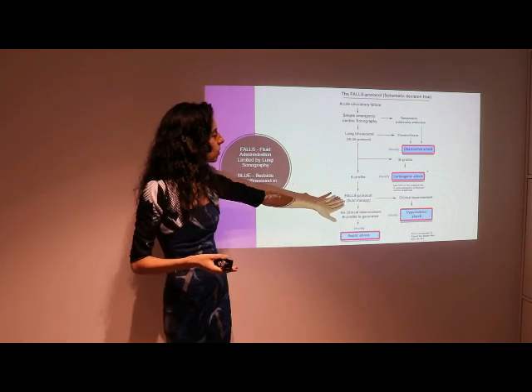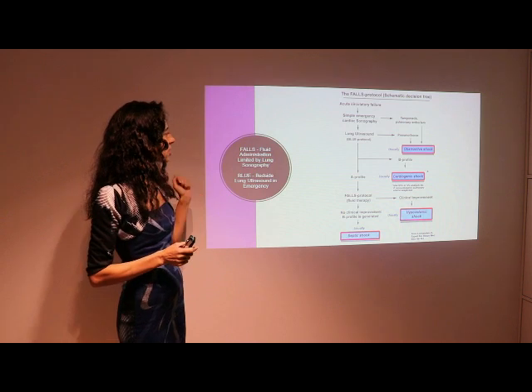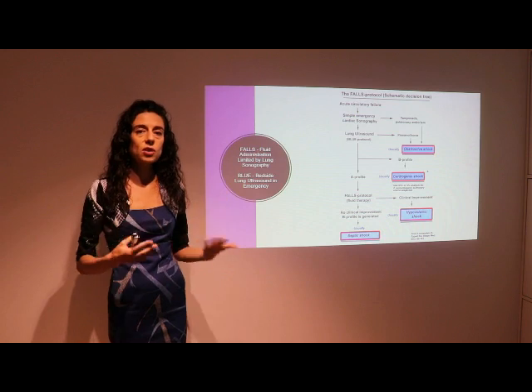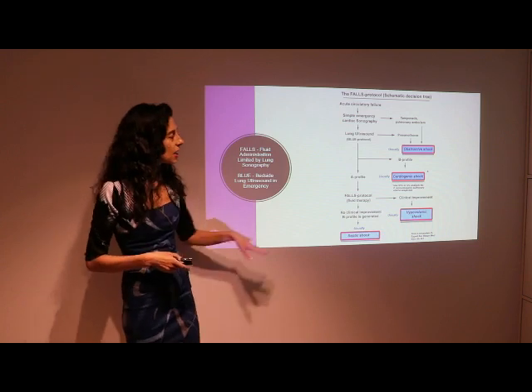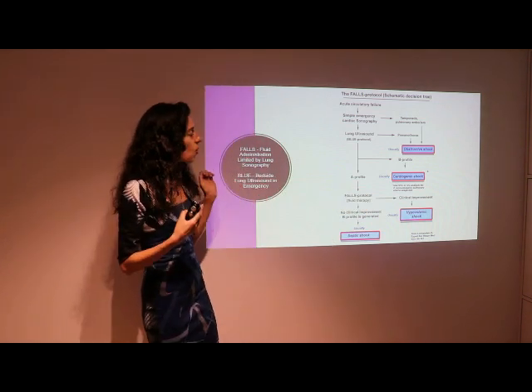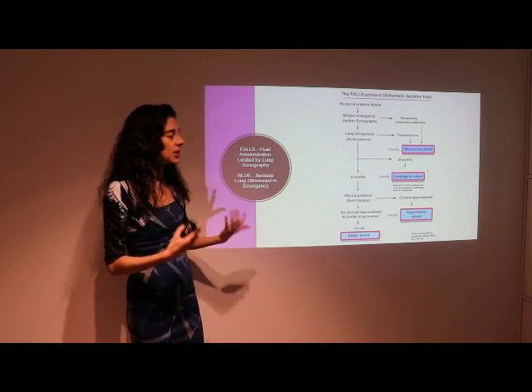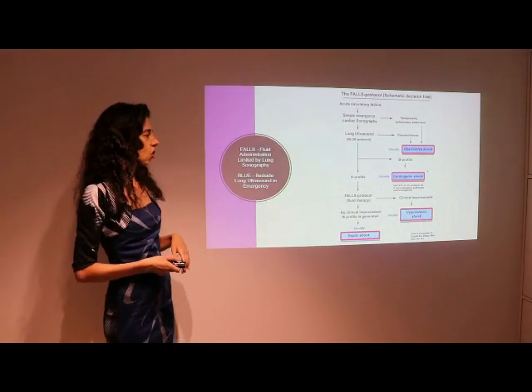If you have an A profile, then you start with another protocol, the so-called FALLS protocol, which stands for fluid administration limited by lung sonography. So this means that you start the fluid therapy and follow the patient with lung ultrasound. If the patient gets clinical improvement, then probably it has been a hypovolemic shock. However, if there is no clinical improvement and a B profile is generating during this fluid therapy, then this means usually that you have a septic shock.